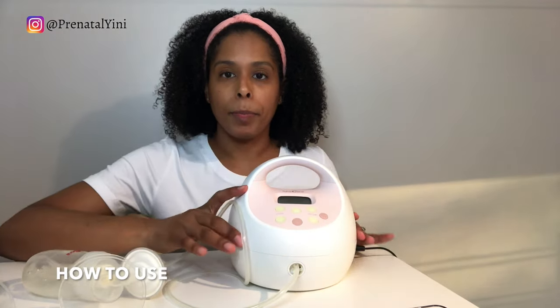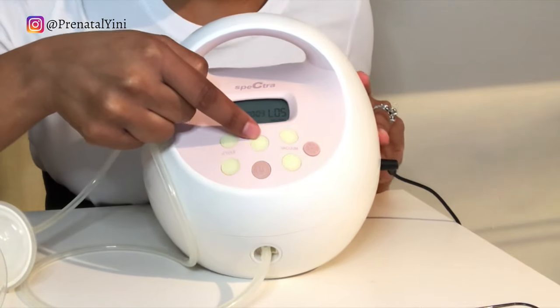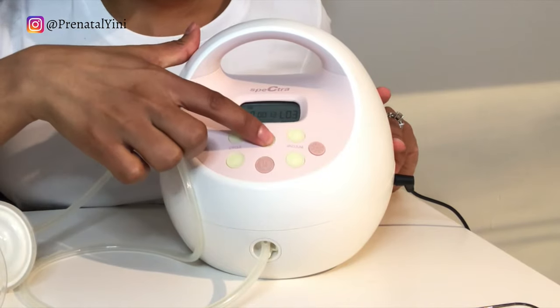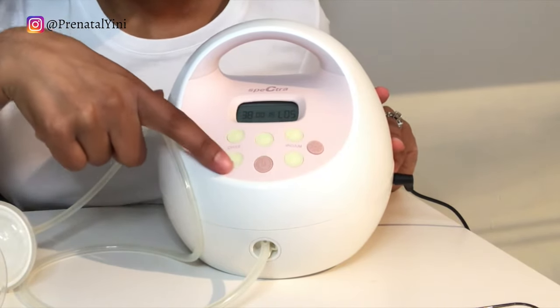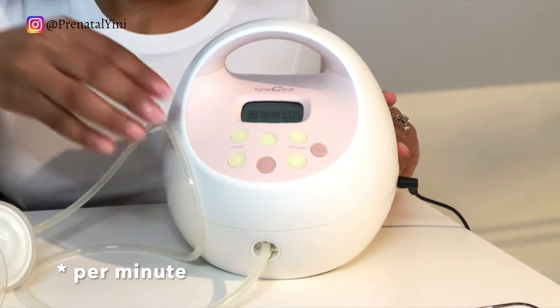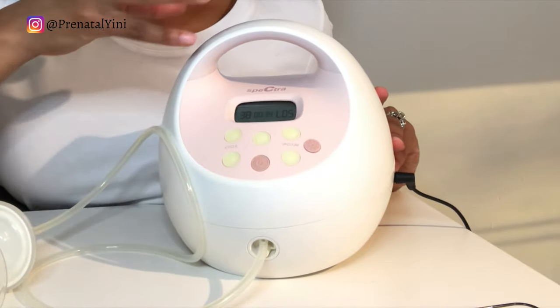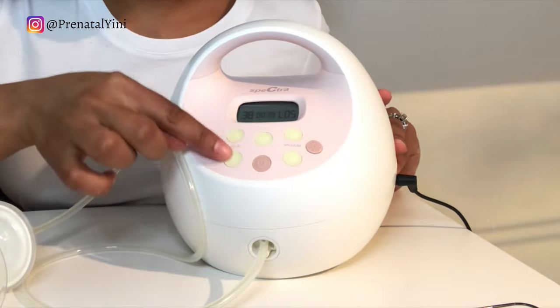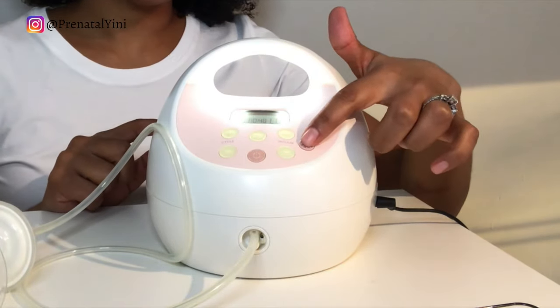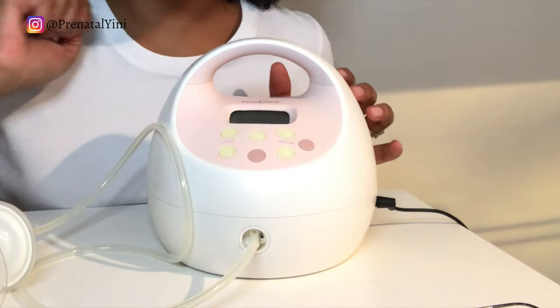Let's review the buttons. The power button turns the machine on. The button with three little lines switches between modes — stimulation massage mode and expression mode. The cycle plus and minus controls how many times the machine pulls and releases your nipple per minute. The vacuum plus and minus controls the strength of the suction. There's also a backlight button with two brightness settings.